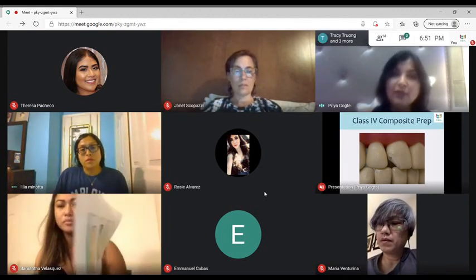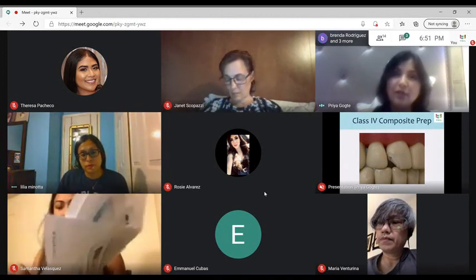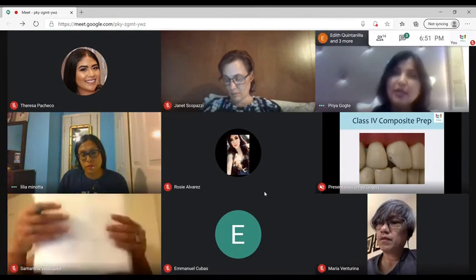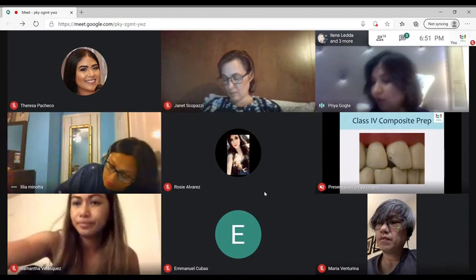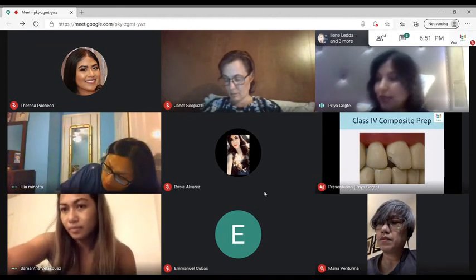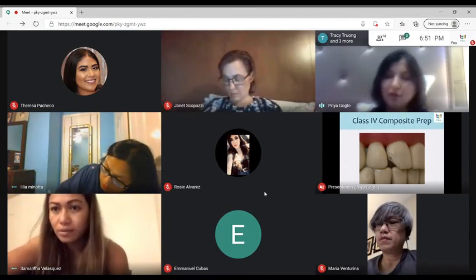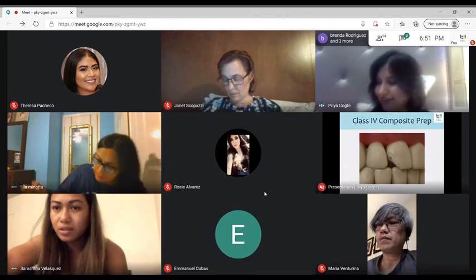And if we have to place a bevel, it's going to be a very slight bevel of 0.5 to 1 millimeter. But for class 4s, can somebody tell me how big the bevel should be in class 4 cavities? 1.5 to 2 millimeter. Oh, wow. Good. Awesome. You guys are all prepared. I'm proud.